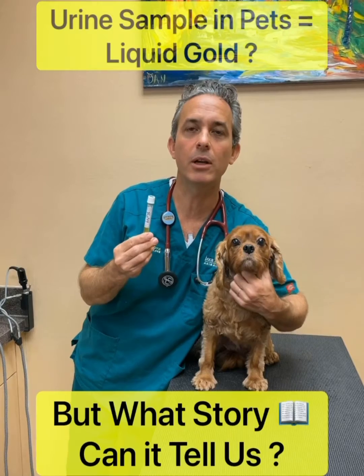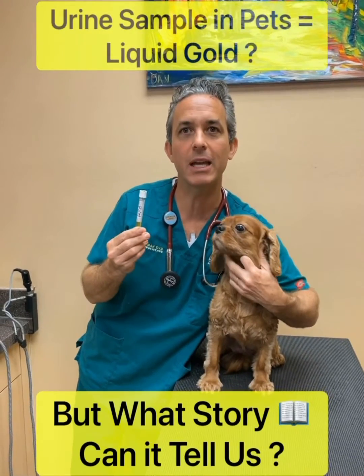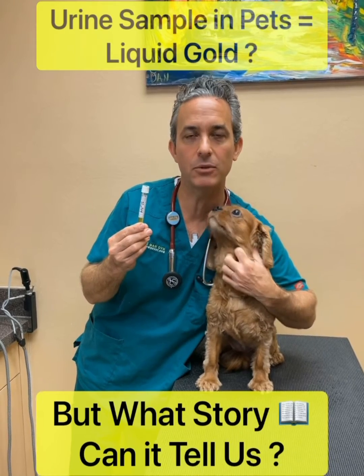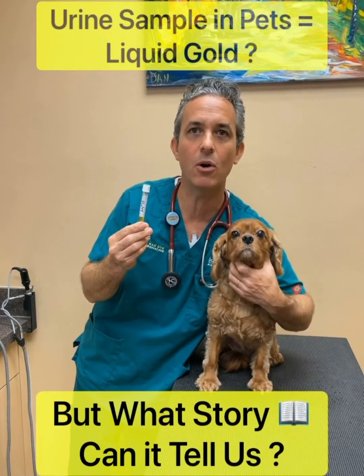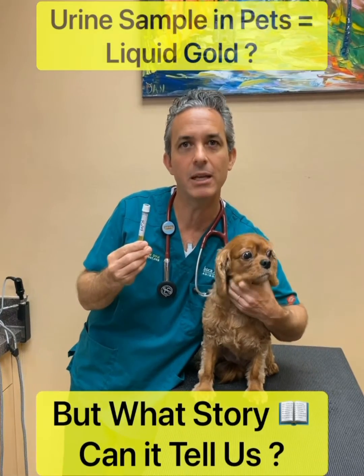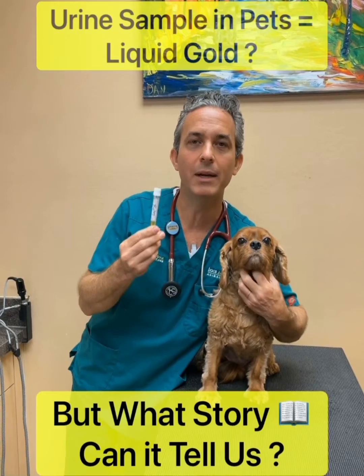We're also looking for any abnormal cells like white blood cells or crystals, which can be indicative of bladder stones. We'll be looking for sugar in the urine, which can be evidence of diabetes, as well as urine concentration, which tells us about kidney function. That's why urine is also called liquid gold.